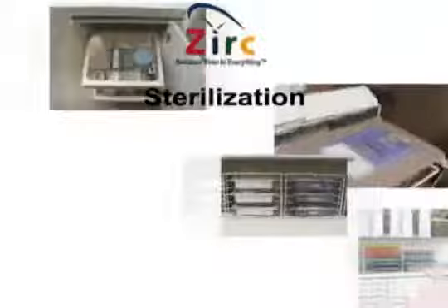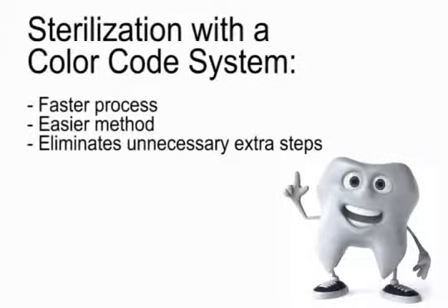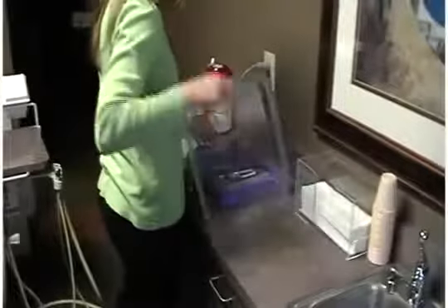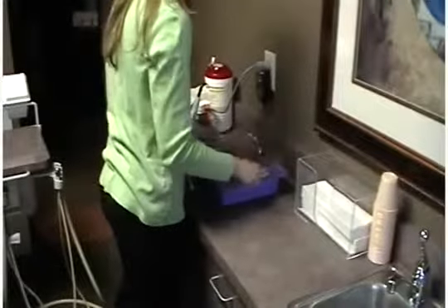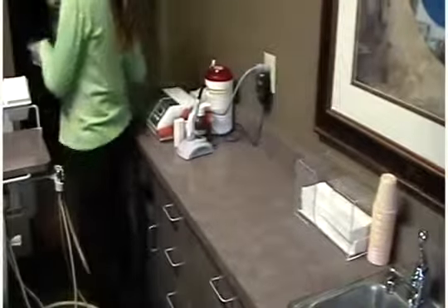Sterilization. The color code system makes the sterilization process faster, easier, and eliminates unnecessary extra steps. The tub was already surface disinfected and now can be placed back into your cabinetry. It is ready for use for the next time the procedure is performed.